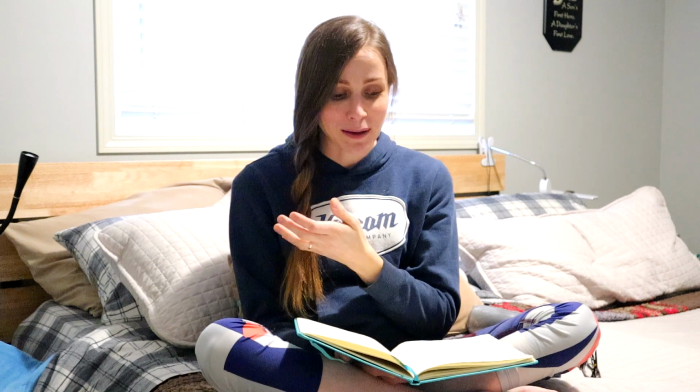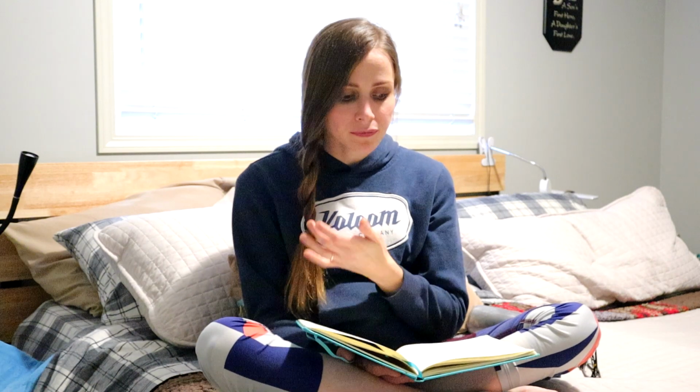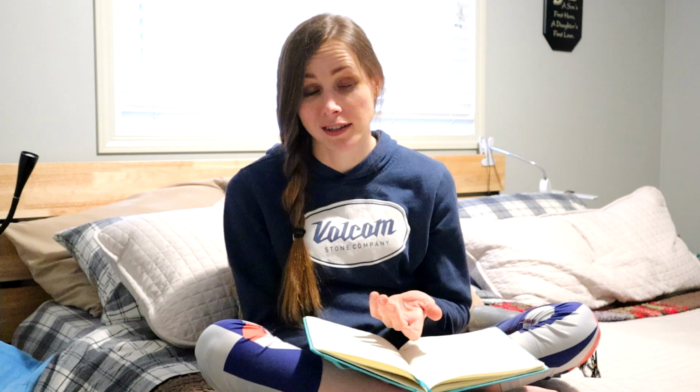I already mentioned that. It's cumbersome to be able to manage the bag for the catheter and the catheter itself. You have to constantly be paying attention to that when you're getting dressed and covering it with clothes. And it can make intimacy a challenge. So that's probably why intermittent catheterization is more popular, except for people with less function and hand dexterity, because there are quite a few cons of an indwelling catheter. So that is how to pee when you're paralyzed.